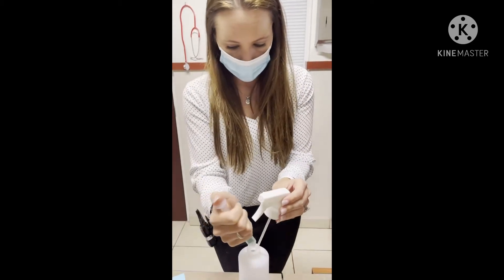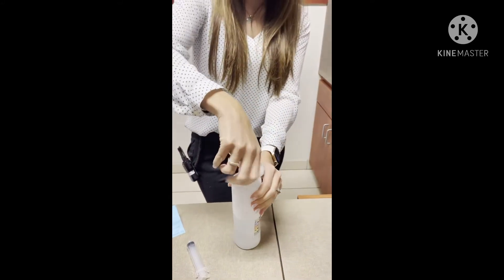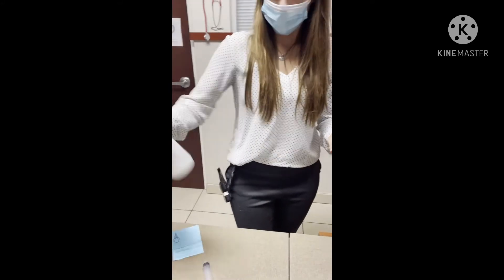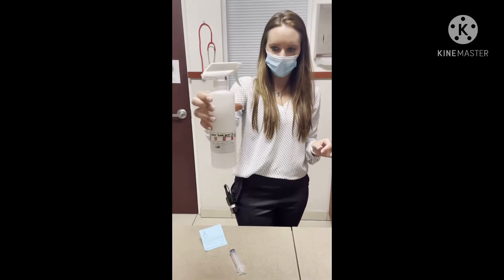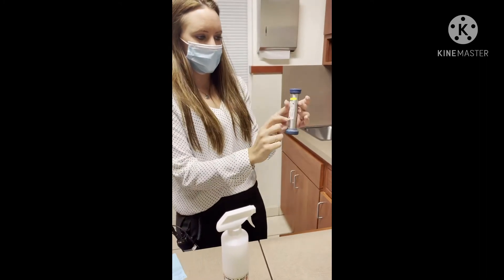I'm just going to put it in my bottle here and mix it all up like that. Then this solution is what's going to be poured into here.